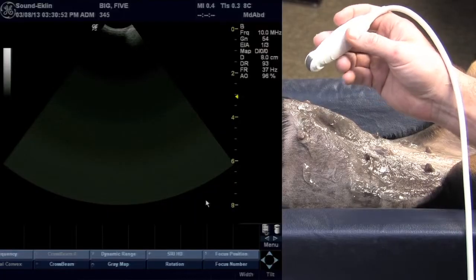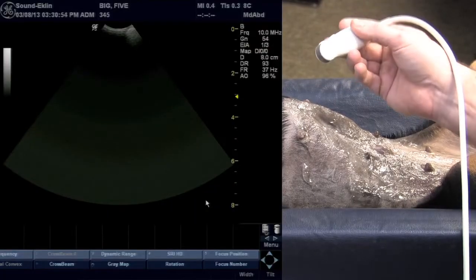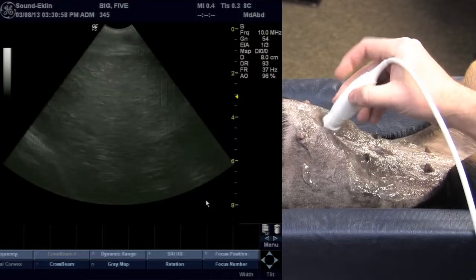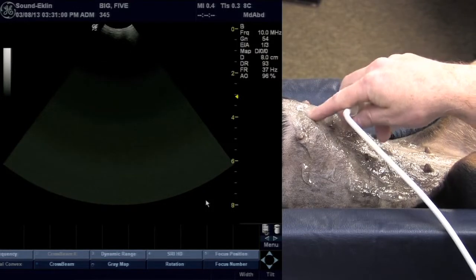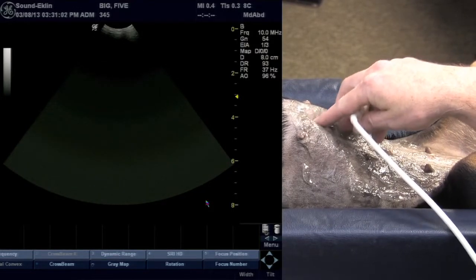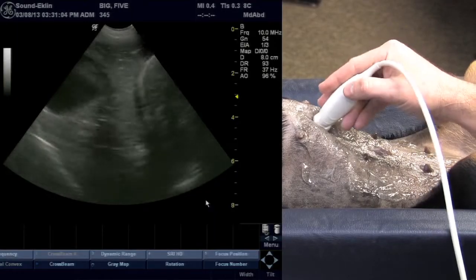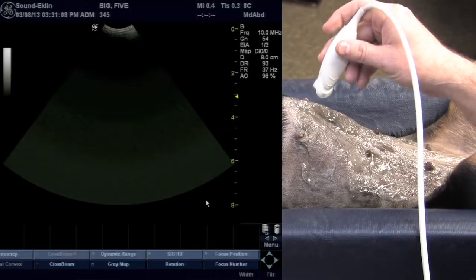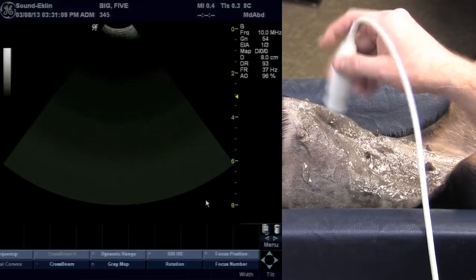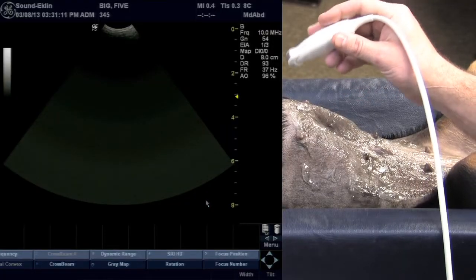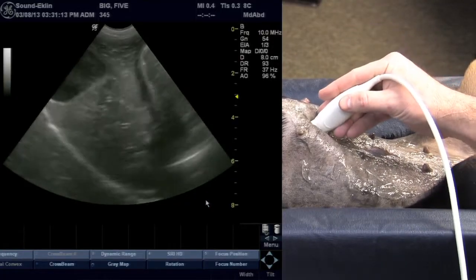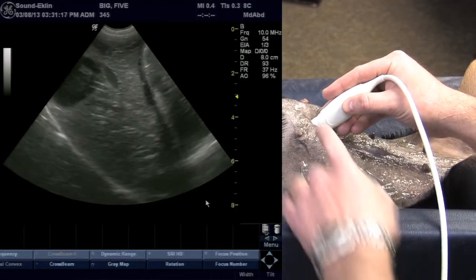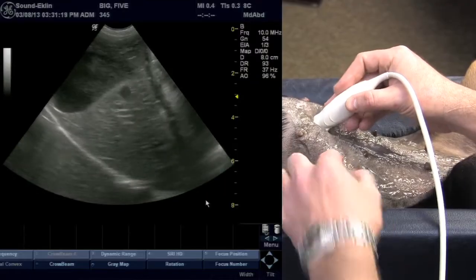I've chosen to start with an 8C probe, which is a microconvex probe. This will allow us to manipulate underneath the ribs. I'll typically start by palpating the xiphoid — that's going to be considered midline — and we'll start with the probe in a long axis plane or sagittal plane with the reference marker towards the head. I will angle that probe underneath the ribs, remembering that the liver is sitting under that rib cage.